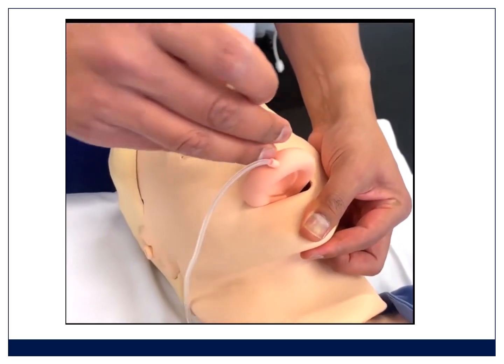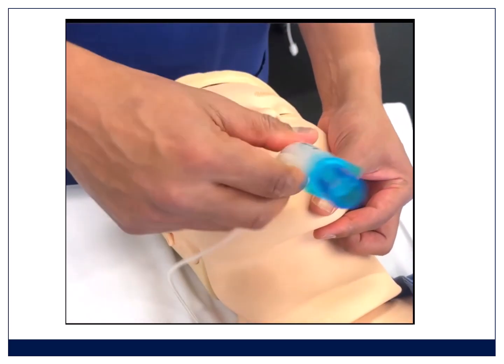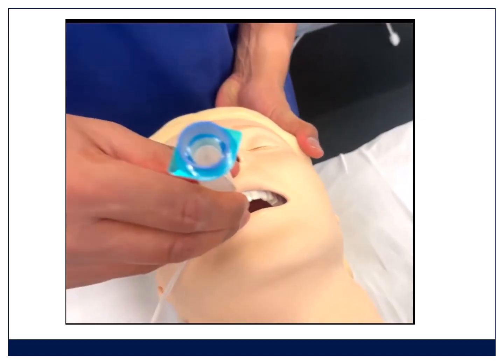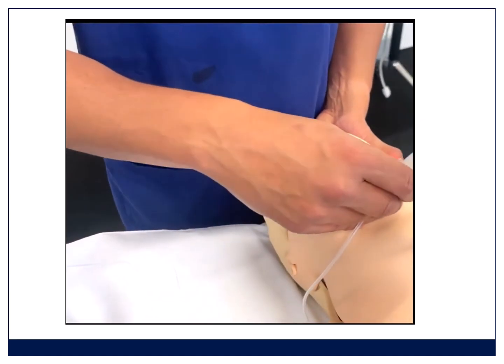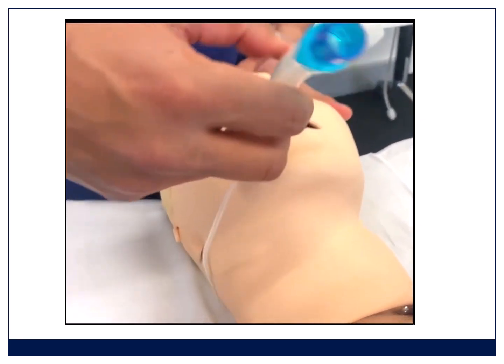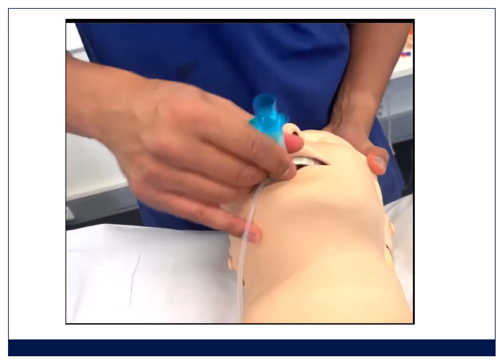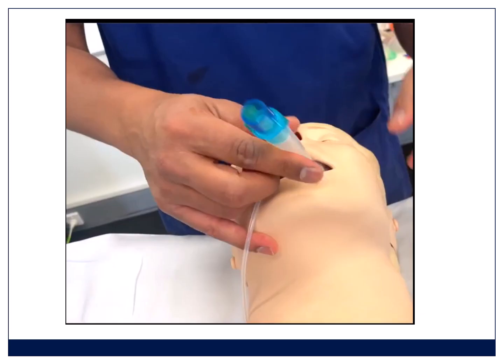So you open the jaw a little bit, get it over the teeth. The first resistance you feel is the tongue. We often extend the neck a little bit and we push it against the tongue. You can see there's some resistance that he's encountering here, so he gives it a little bit more pressure and pushes it over the tongue and then feels it bite and sit correctly.